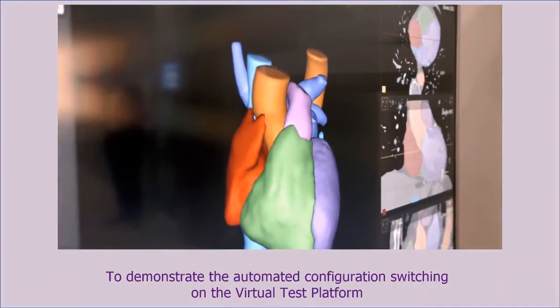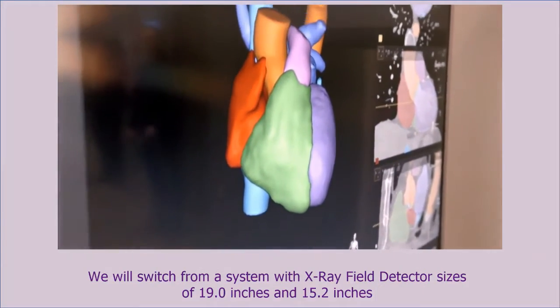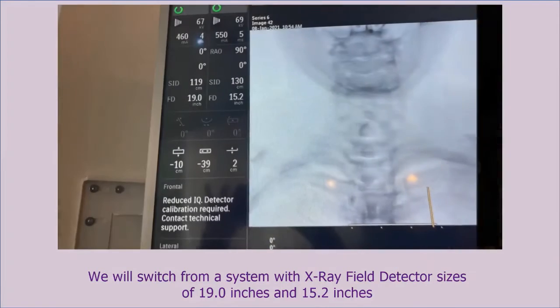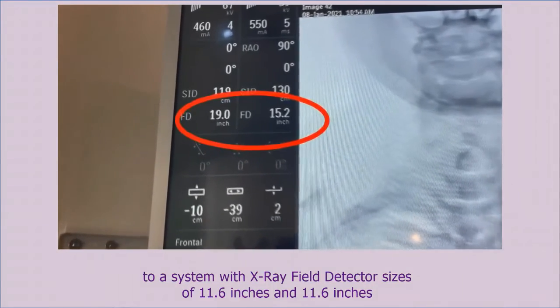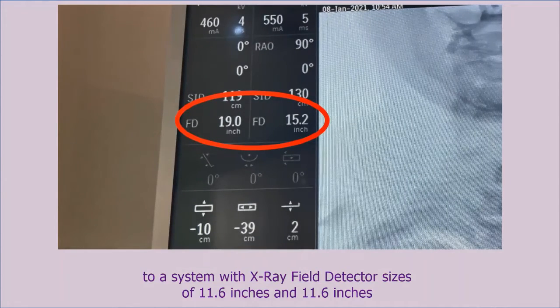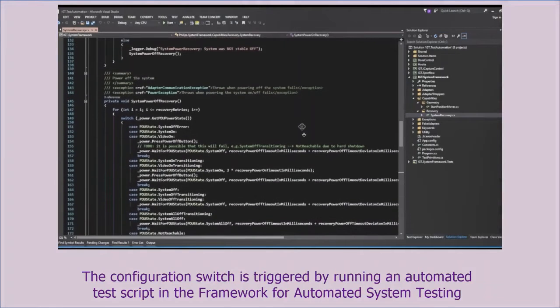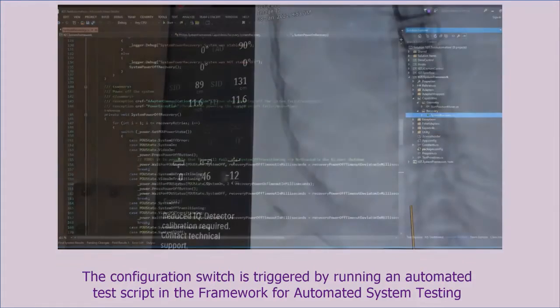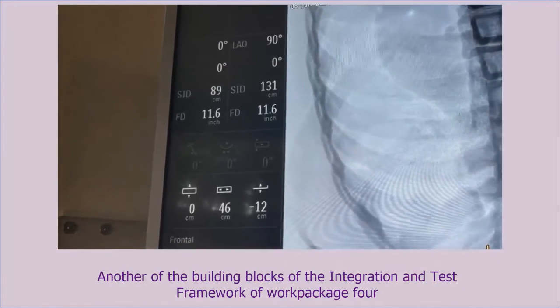To demonstrate the automated configuration switching on the virtual test platform, we will switch from a system with X-ray field detector sizes of 19.0 inches and 15.2 inches, as shown on the system monitors, to a system with X-ray field detector sizes of 11.6 inches and 11.6 inches. The configuration switch is triggered by running an automated test script in the framework for automated system testing, another of the building blocks of the integration and test framework of Work Package 4.